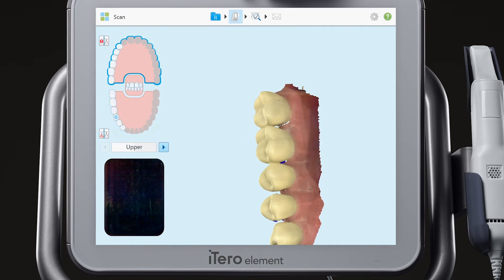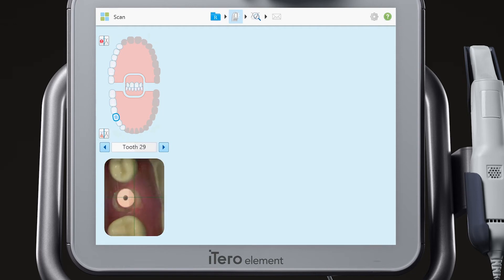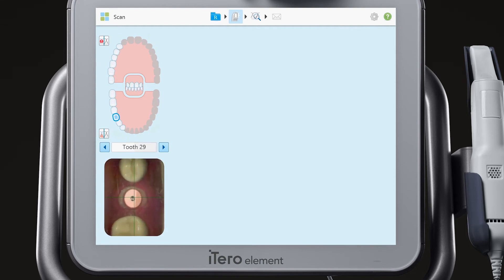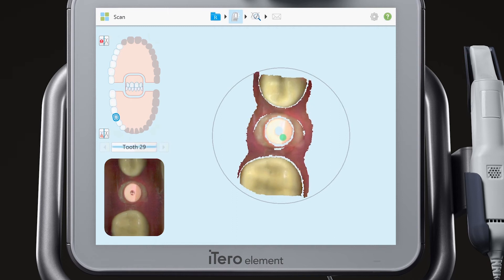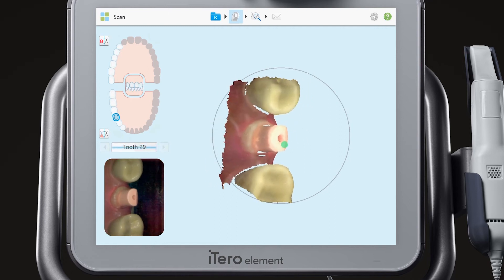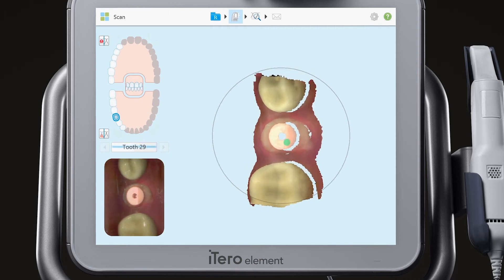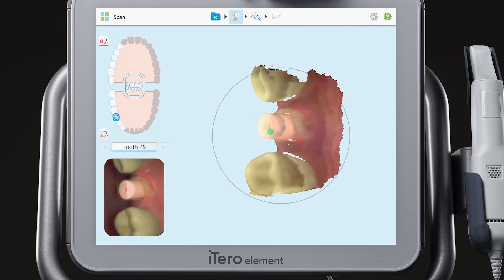Use the arrows next to the segment indicator box to move to the next segment, the scan body segment. Scan the occlusal, lingual, and buccal of the scan body.